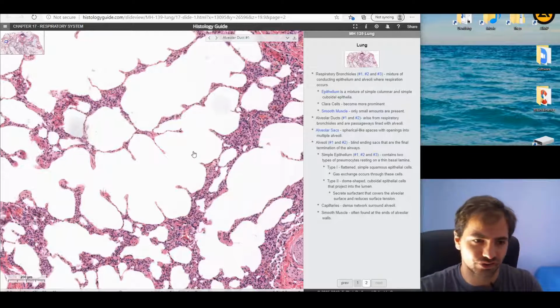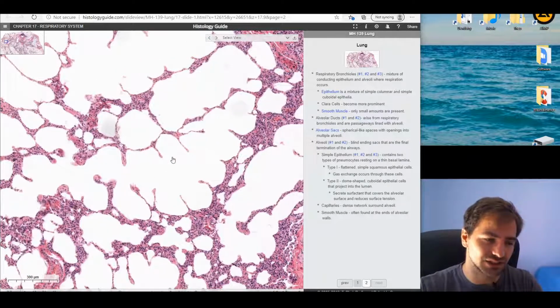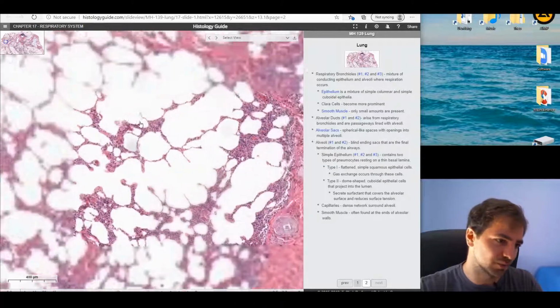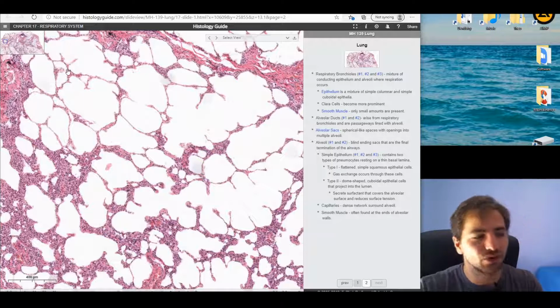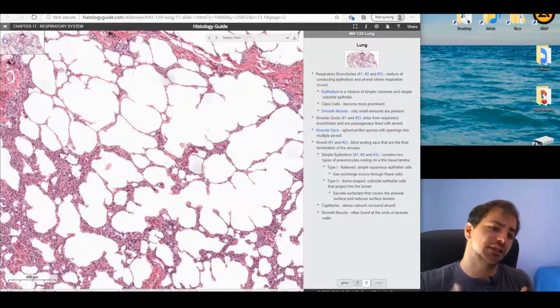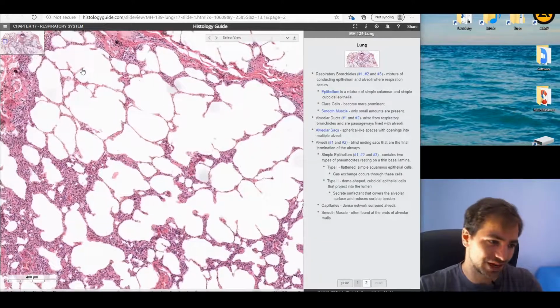One trick to do it is, of course, with the diameter and the size of the opening. For example, as you can start seeing, this is the typical alveoli. This is the alveoli, the smallest branch. And now you should compare based on this size a bit bigger, more alveoli present is the sac.